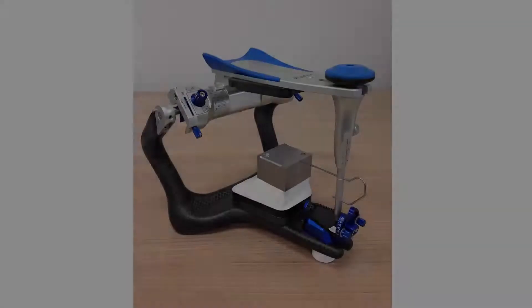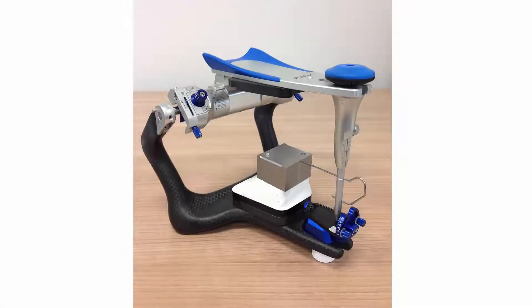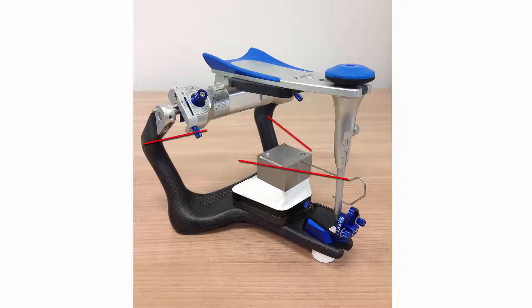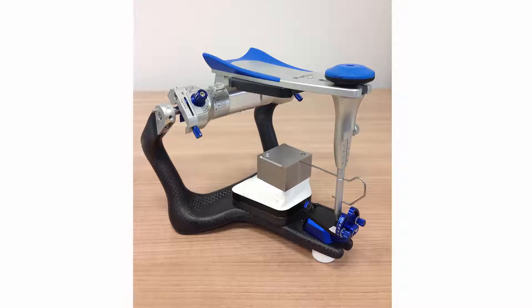To start calibration, first mount the lower part of the Occlusal Transfer Calibration object on the cast mounting plate in the articulator. The contact surface of both parts should be located approximately in the sagittal plane of the articulator, and the incisal indicator should be aligned with the vertical notch on the calibration object.